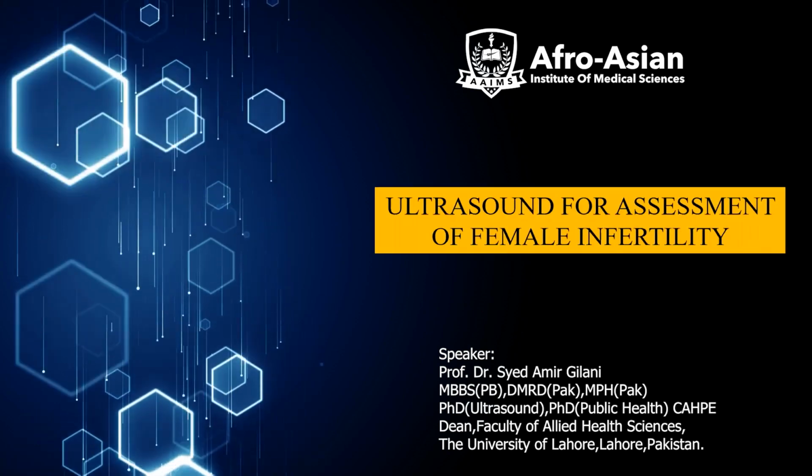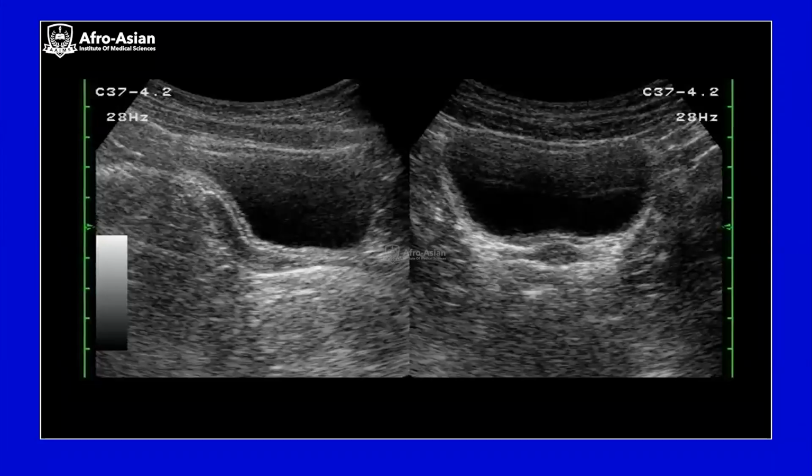Ultrasound for assessment of female infertility. There are two types of patients who are coming for ultrasound or referred for ultrasound with complaints of infertility. The one is the primary infertility and second is secondary infertility. In cases of primary infertility, the patient will usually have a history of amenorrhea if the uterine size is small.